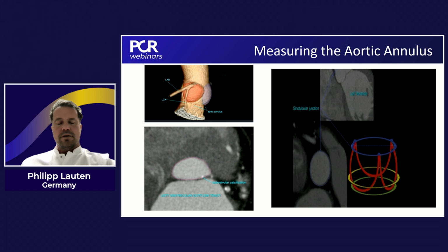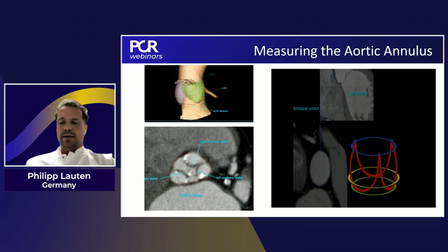mentioned, for the idea of the distribution or the movement of the calcification when you implant the valve, for the idea for the pre-dil, which size of the balloon you use for pre-dil. This is really an important question. It depends also on the calcification amount and the idea to not to pre-dil, just making first implantation, even with self-expandable valve.